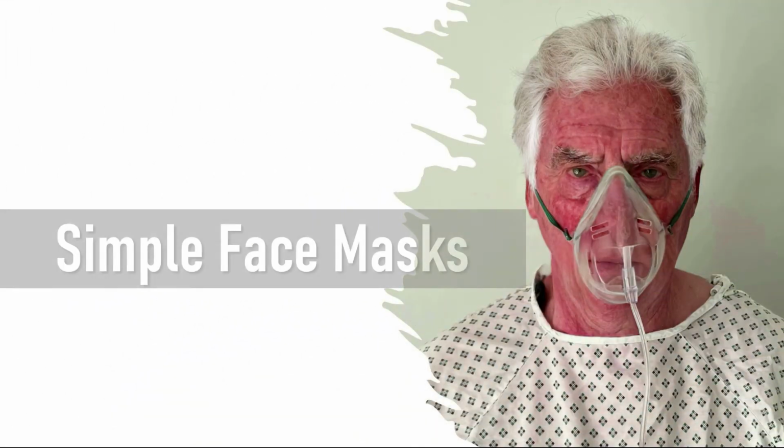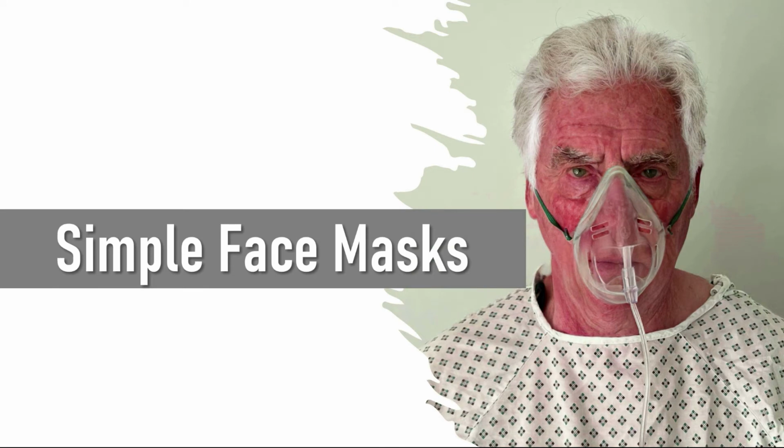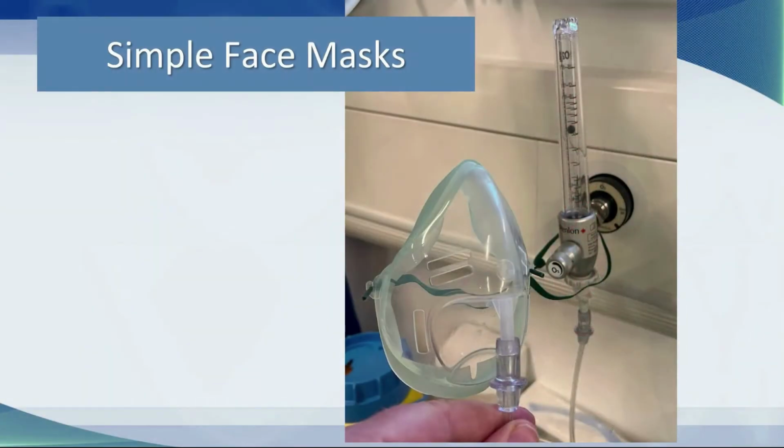Let's move on to face masks. These come in all kinds of shapes and sizes, and I'm going to start with simple masks. These are sometimes known as Hudson masks. This is a standard face mask.